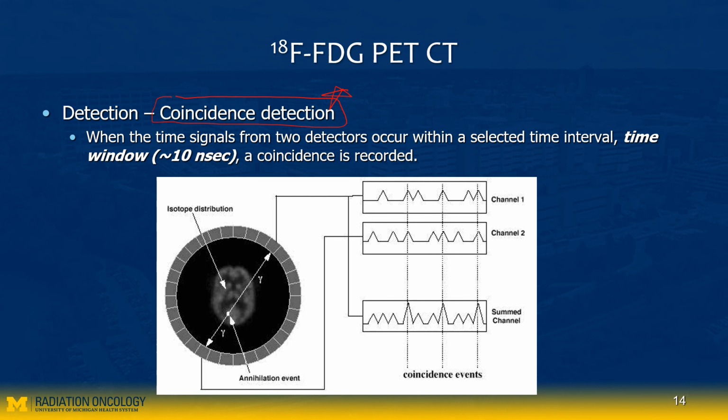All right, so what is that? When the signal is coming from here, you have almost 180-degree apart signals. So this detector and this detector will detect the signal almost at the same time. When I say almost, the traveling distance is different depending on where it originated, but it's the speed of light, so almost identical.